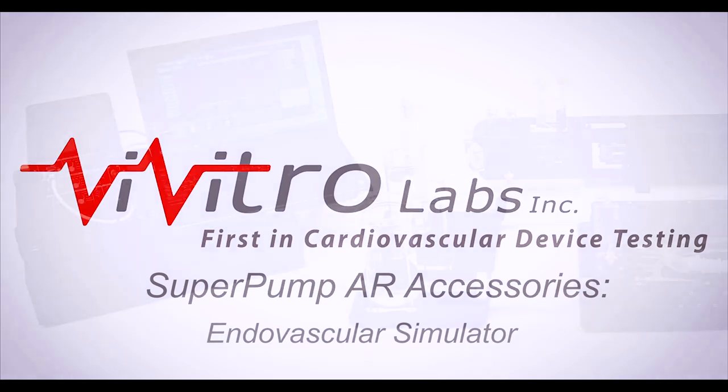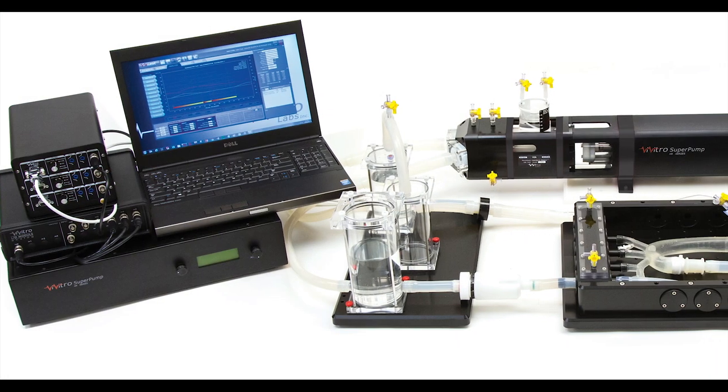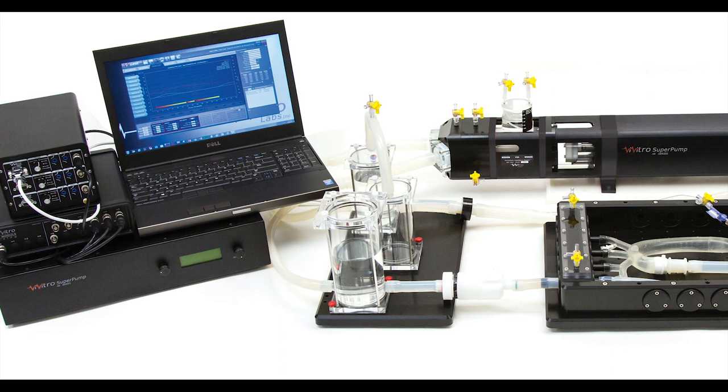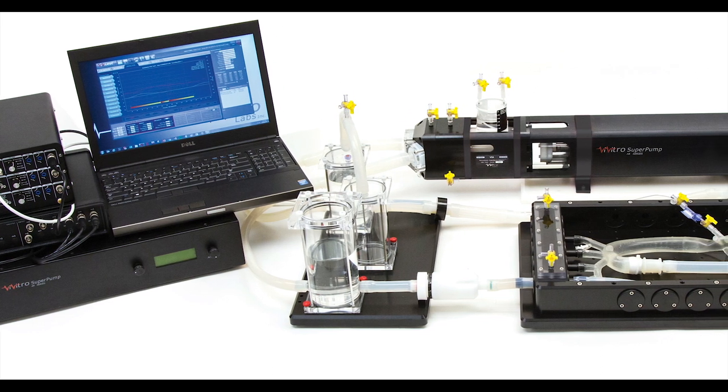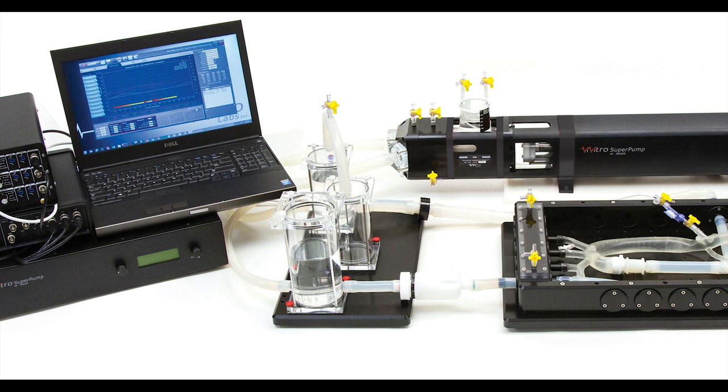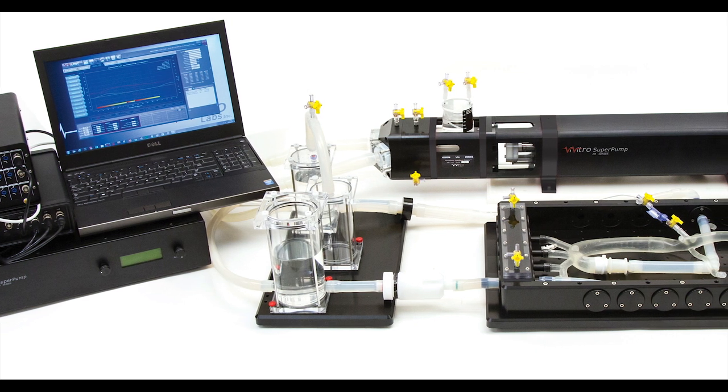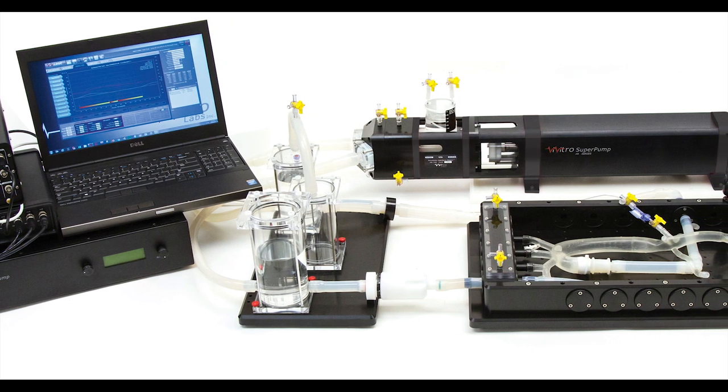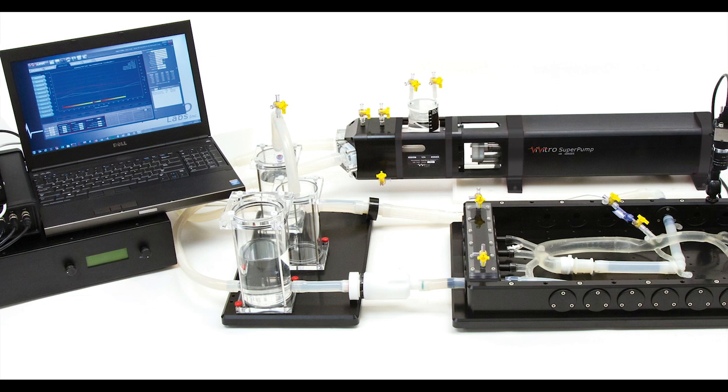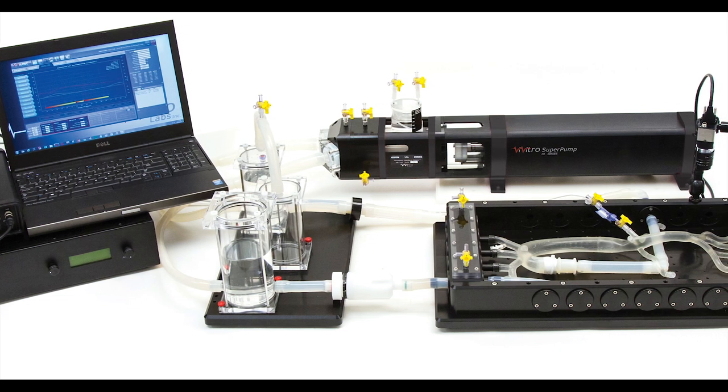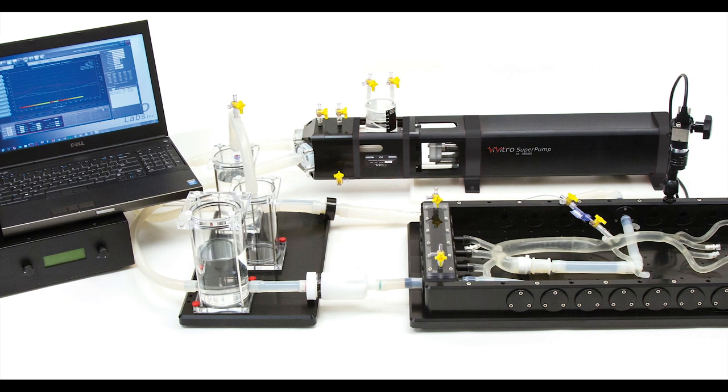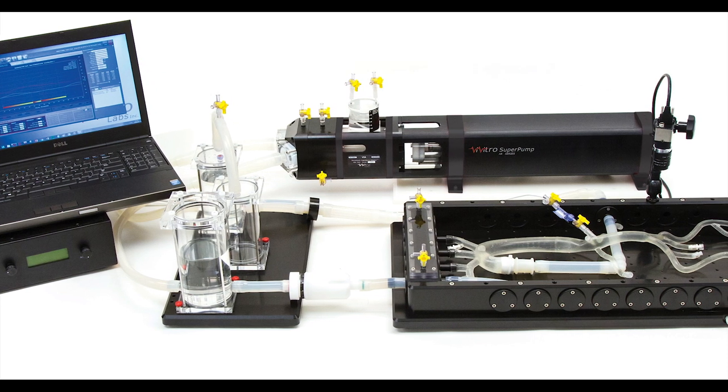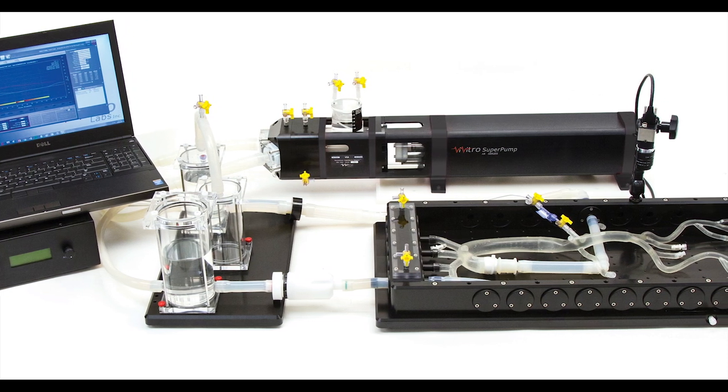The super pump can also be used to drive the endovascular simulator to bring physiological pulsatility to anatomical models for research and development. The endovascular simulator tray is a modular platform that accommodates anatomical models for a variety of transcatheter or surgical vascular interventions. It is easily reconfigured for different model sizes and connection types.